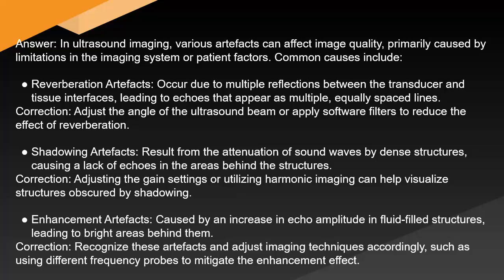Enhancement artifacts are caused by an increase in echo amplitude in fluid-filled structures, leading to bright areas behind them. Correction: recognize these artifacts and adjust imaging techniques accordingly, such as using different frequency probes to mitigate the enhancement effect.